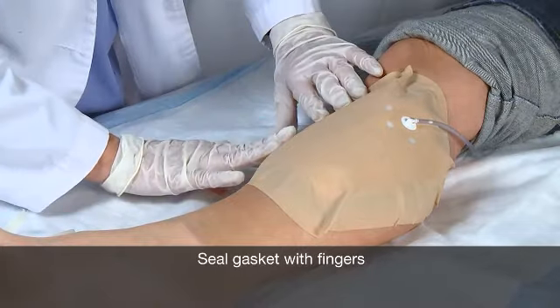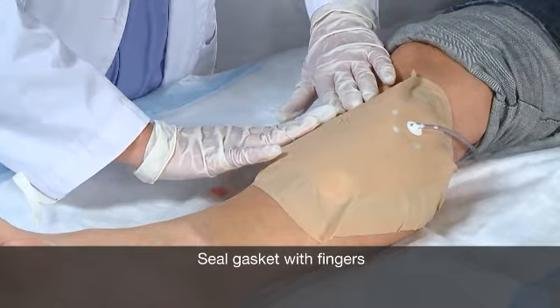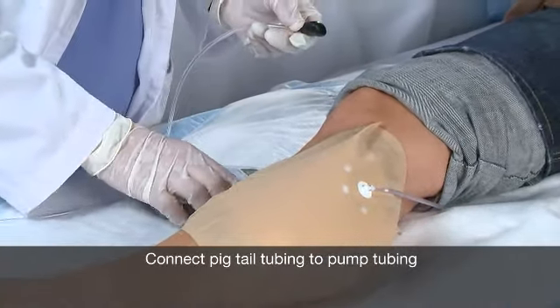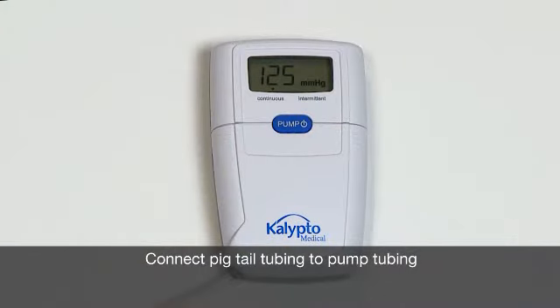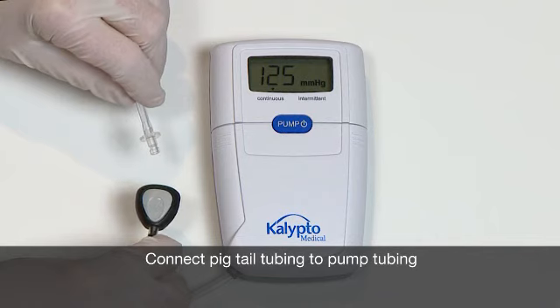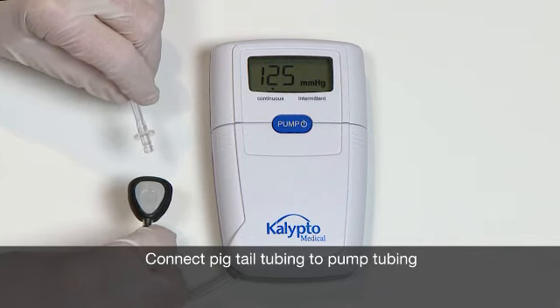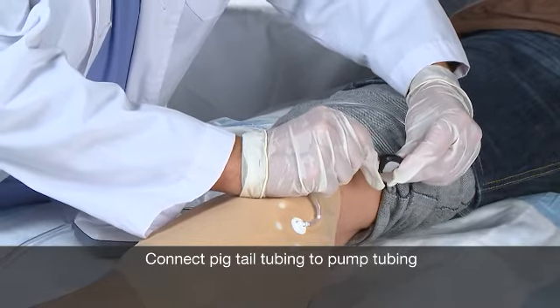The application of negative pressure will cause the wound kit to conform to the surface of the wound. Once you have finished applying a Calypto Medical Wound Kit, it is time to attach the wound kit to the pump. Grasp the end of the pigtail tubing that isn't attached to the wound kit in one hand, and the black connector port at the bottom of the pump tubing in the other. Gently push these two ends together. You will hear a soft click that ensures the connection is secure.